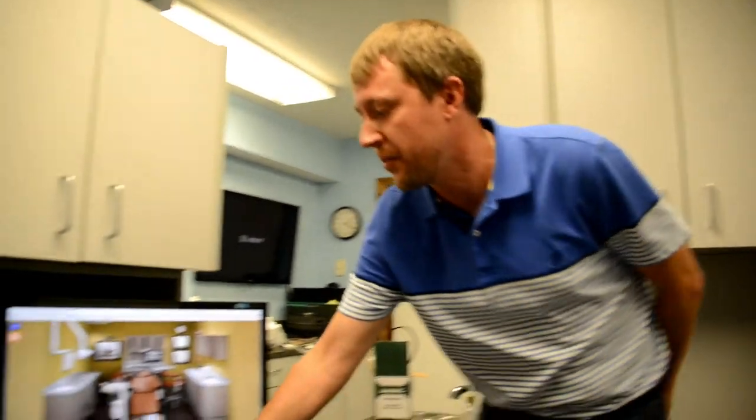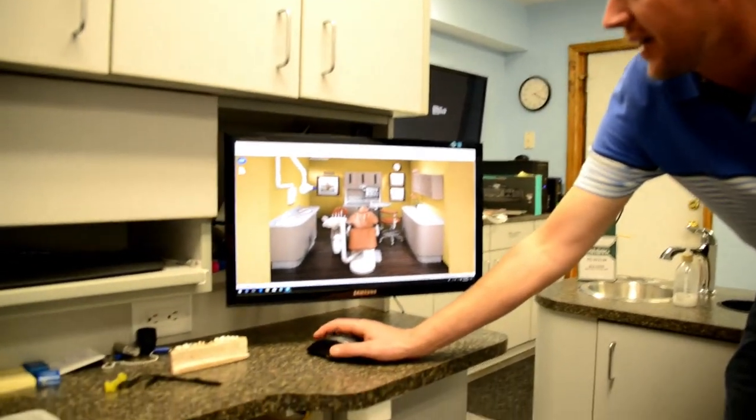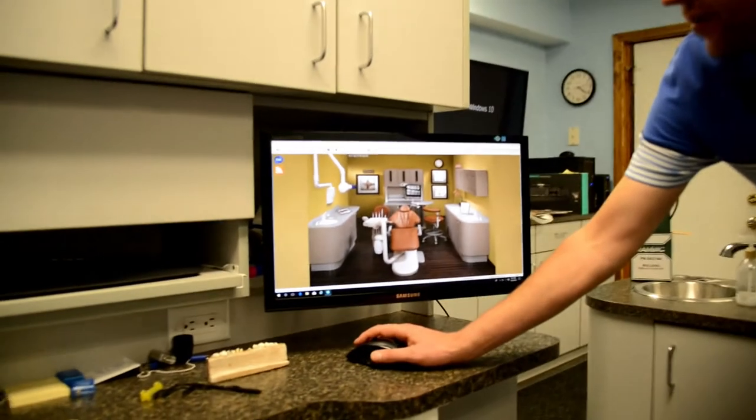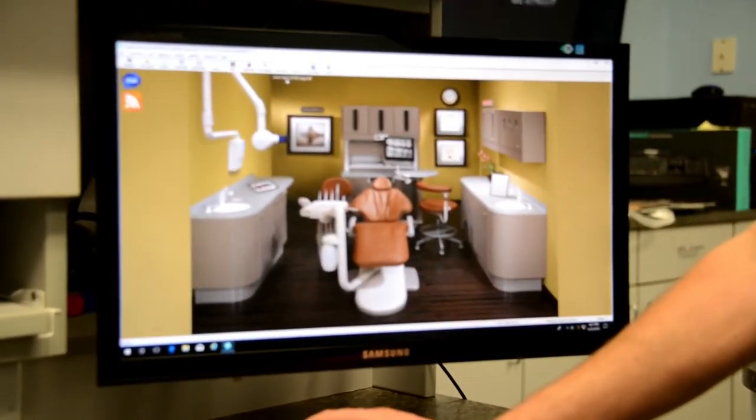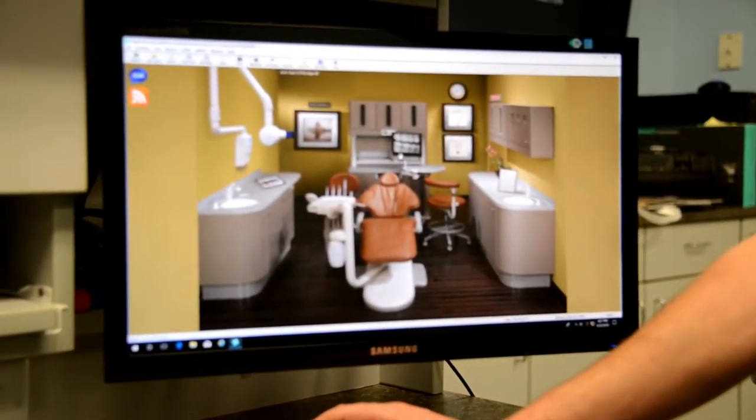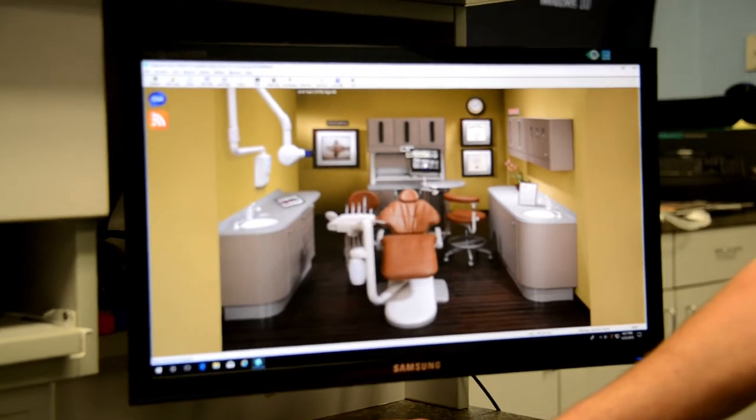First what I'm going to do is I will select our patient. We've just got a test patient open. I'll select the imaging module.